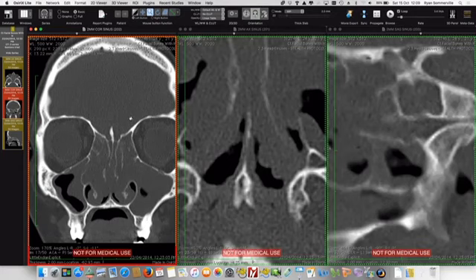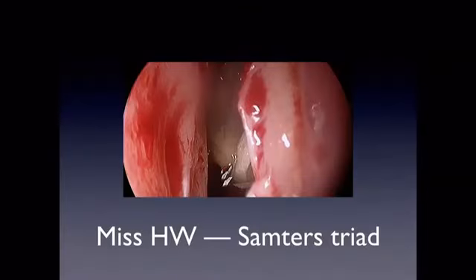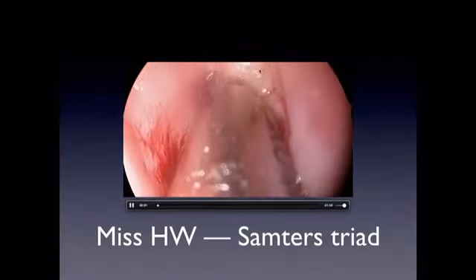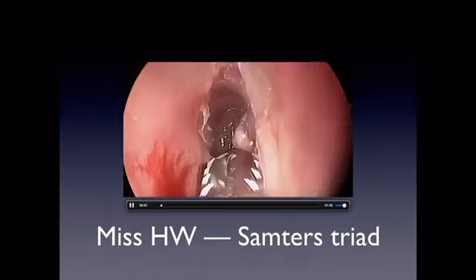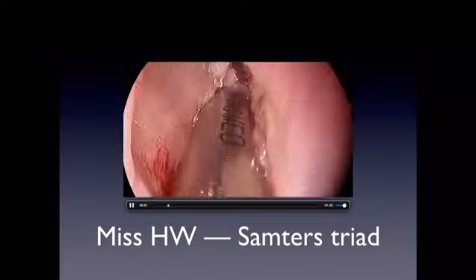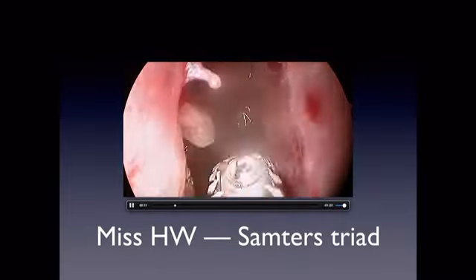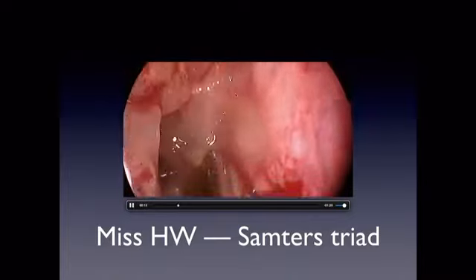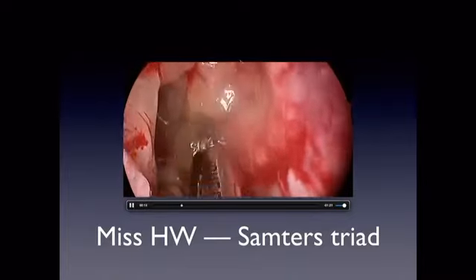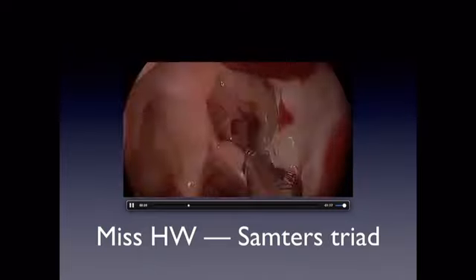And so if we go to her video, once again, patient's right-hand side, a lot of scarring through there. These polyps are not too hemorrhagic, and that's after 6 months of planning. And so we're able to do the operation quite safely. So we're getting to the bottom of where everyone's achieved before. You can see here, a bit of scarring up through there. This is basically just above here in the ethmoids is where I was able to achieve last time.